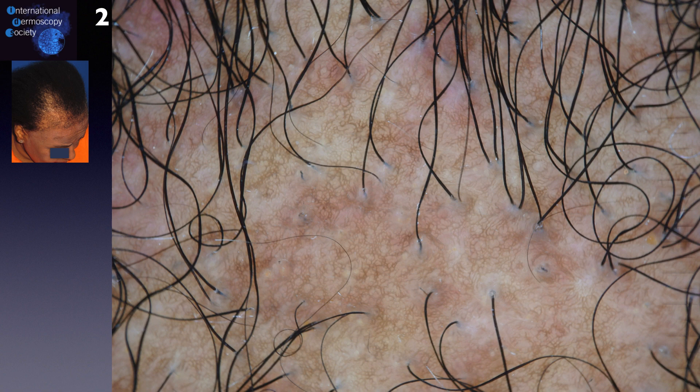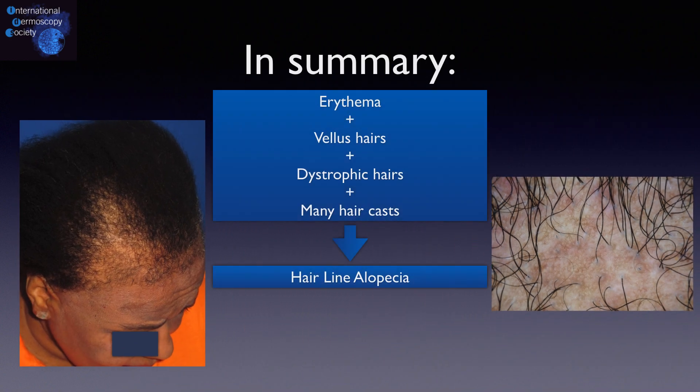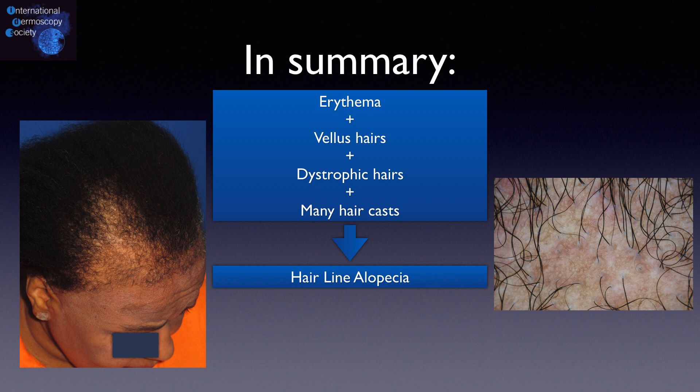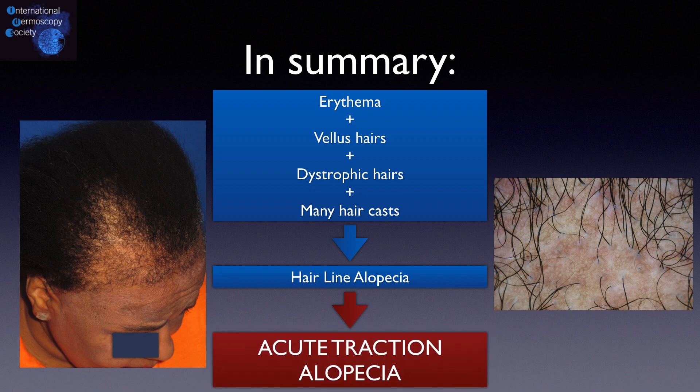Here is another tricoscopy of the same patient with no hair casts. In summary, the presence of erythema, vellus hairs, dystrophic hairs, and many hair casts placed on the hairline in a patient with a history of traction suggests the diagnosis of acute traction alopecia.